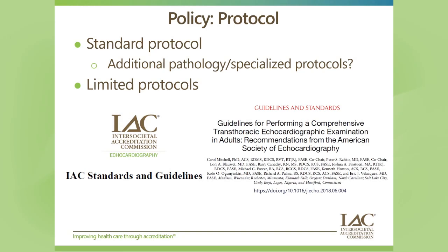And also thinking about that we're not just taking images to take images, right? So kind of thinking through that as you're doing your exam. Also thinking about things like limited protocols, when those are appropriate, depending on when was the last time this individual may have been scanned.